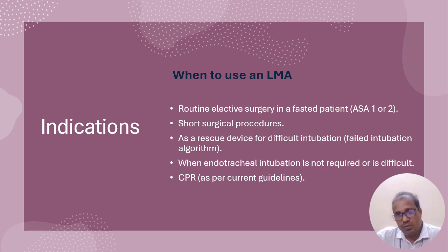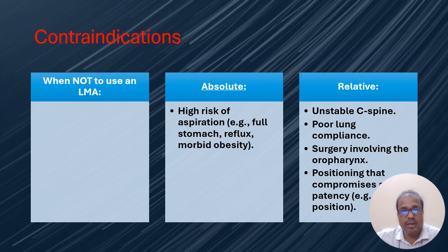We will never use the LMA in those. In case of failed intubation or difficulty in any emergency situation, we can also use LMA. And in modern guidelines, in case of CPR, LMA is also used.